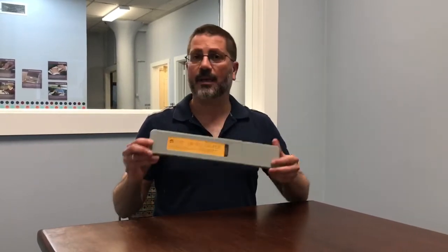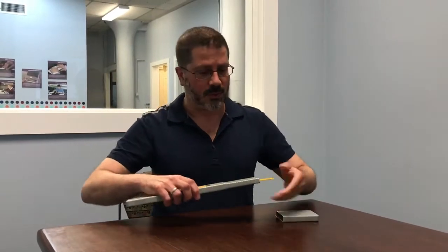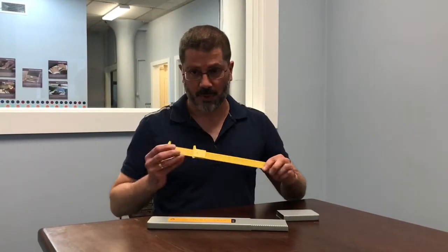Hi, this is Tony Gruma from National Braille Press, and I wanted to take a couple minutes today to tell you about our tactile caliper. This is a device that was made by Squirrel Devices, and NBP is the sole distributor.